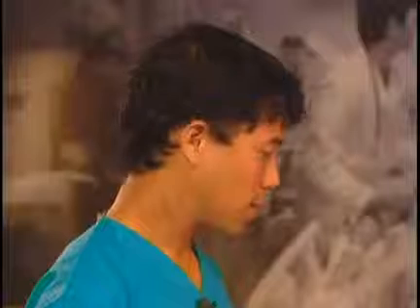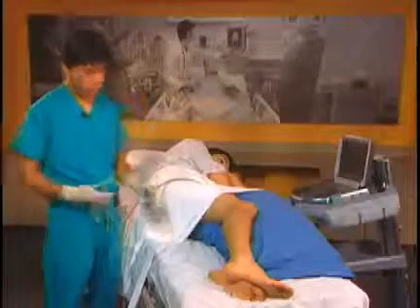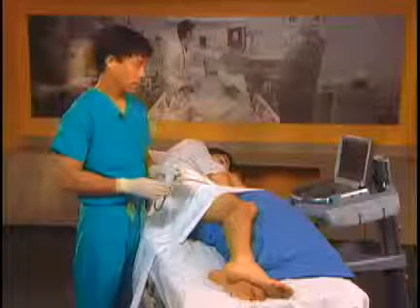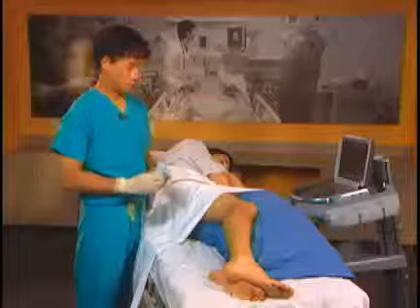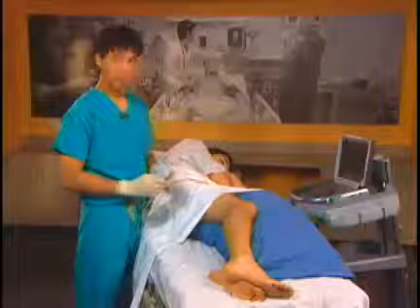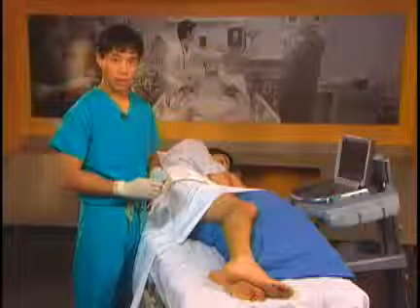I find a lateral position gives you good control of the patient's airway if you sedate them, as well as good ergonomics to do the block. Here we have our patient positioned laterally with a pillow between the legs for comfort. To do the popliteal sciatic nerve block, we use a linear probe. The linear probe allows us to see structures well in the shallow plane, but gives us a wide field of view to see our needle approaching the nerve.